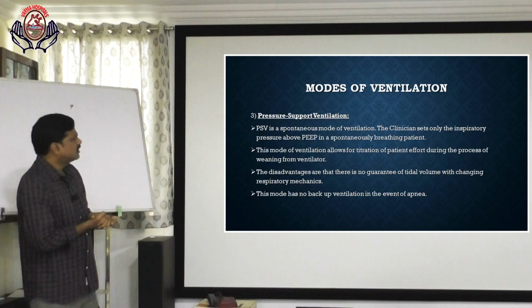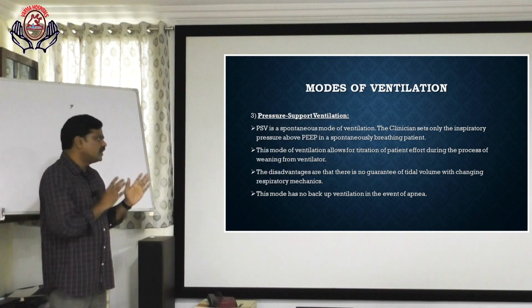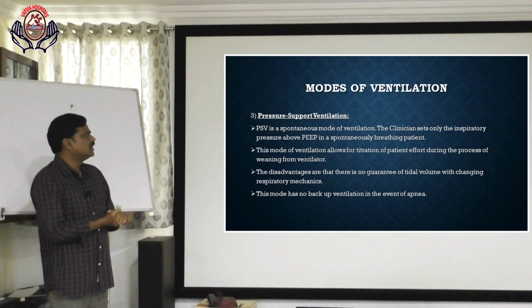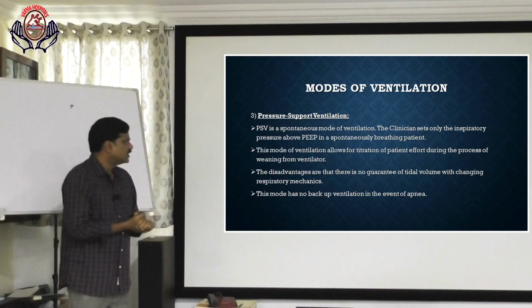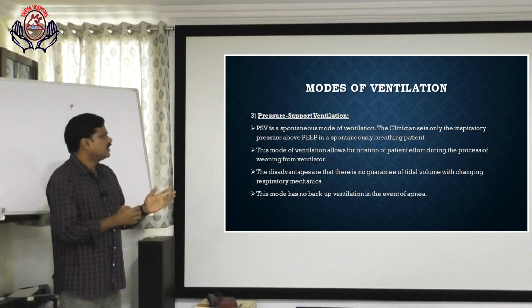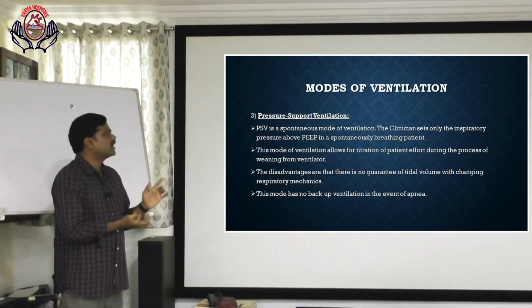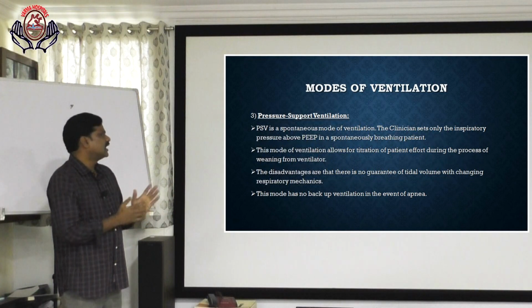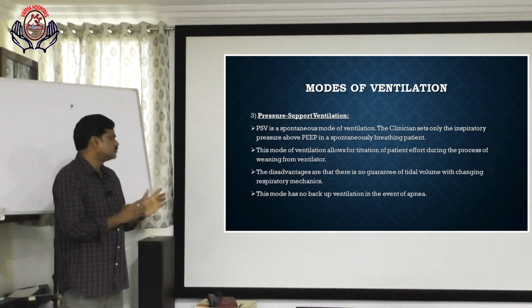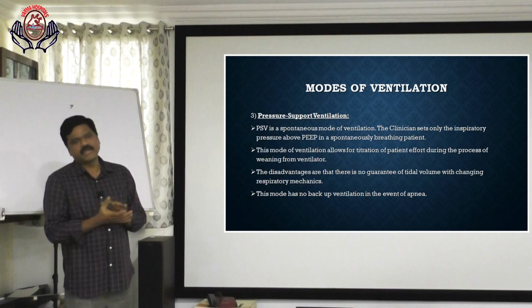Pressure support ventilation, PSV, is a spontaneous mode of ventilation. The clinician sets only the inspiratory pressure above the PEEP in a spontaneously breathing patient. This mode of ventilation allows for titration of patient effort during the process of weaning from the ventilator. The disadvantages are that there is no guarantee of tidal volume with changing respiratory mechanics. This mode has no backup ventilation in the event of apnea.